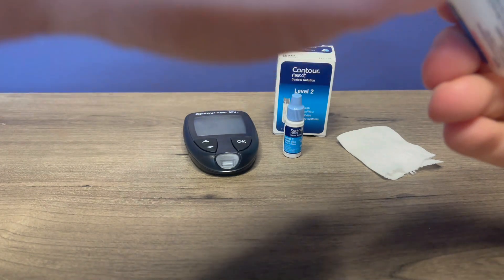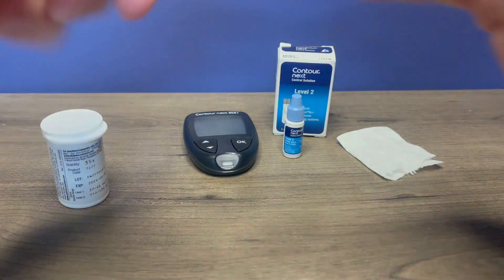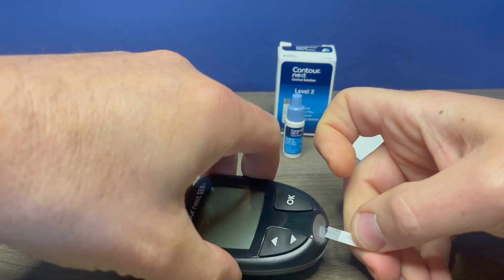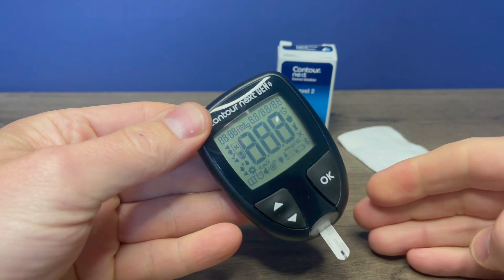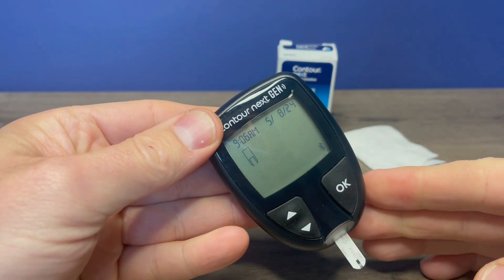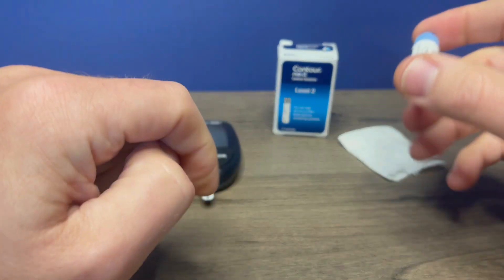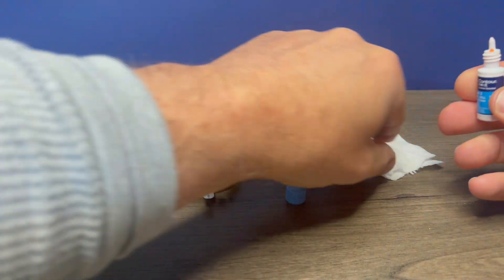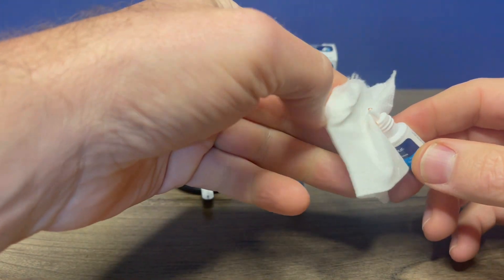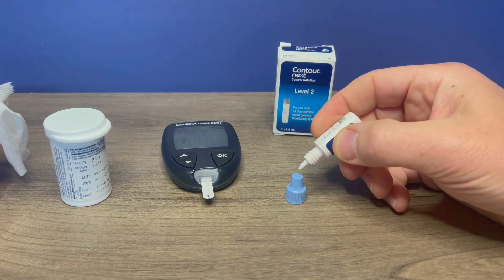First off, you'll want to put a test strip in your meter. And once it's prompting for a drop of blood, we can take our control solution. Make sure we shake it well — I already shook it up good. Put that cap down. Use your tissue to wipe away any solution that may be on the tip, and then put a drop on a non-porous surface.